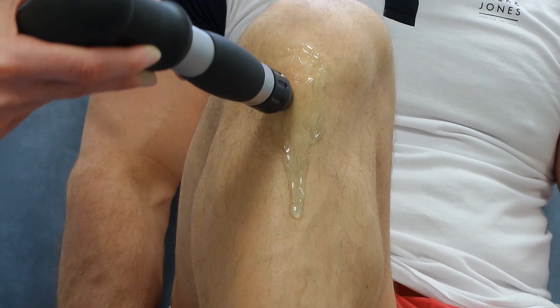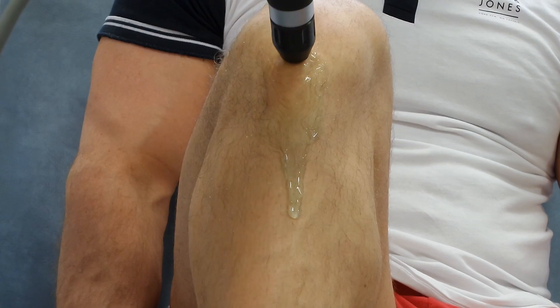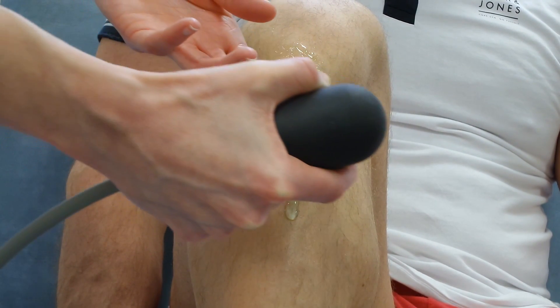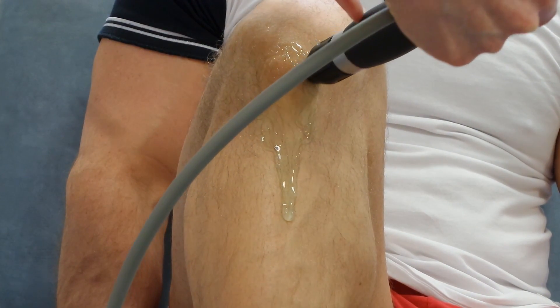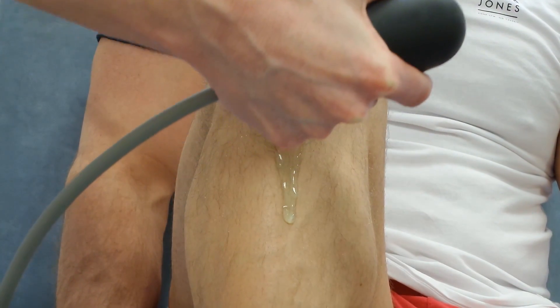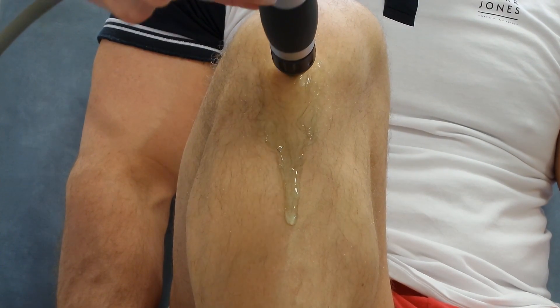If the area were smaller, like the bone spurs you get in the Achilles tendon or into the plantar fascia, you can treat those as a single spot — as shown in some other videos. In this case, the area is too big to treat as a single spot. You could divide the area into smaller spots and do each one for a certain number of shocks, but that approach was not chosen here.